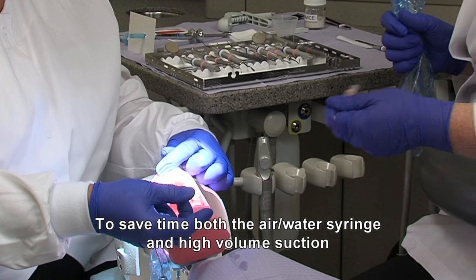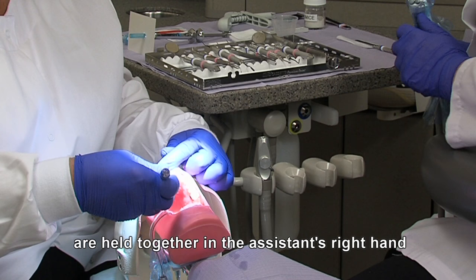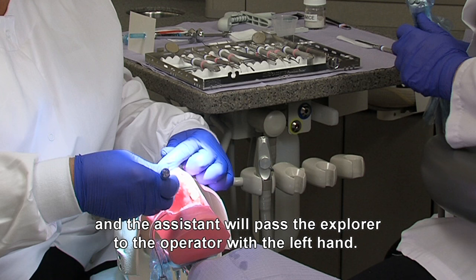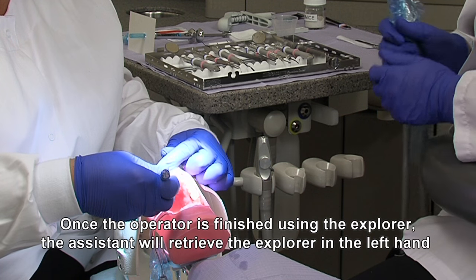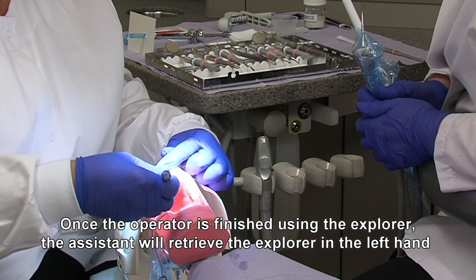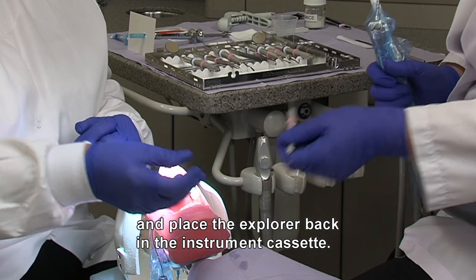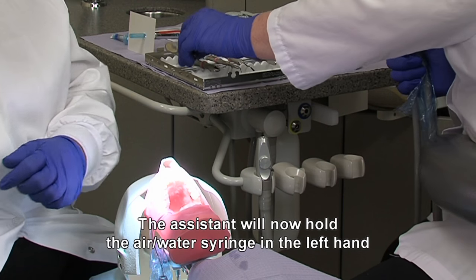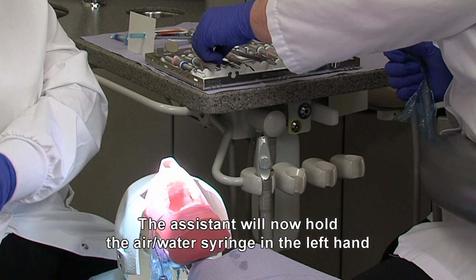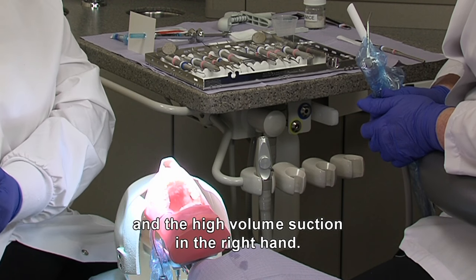To save time, both the air-water syringe and the high-volume suction are held together in the assistant's right hand, and the assistant will pass the explorer to the operator with the left hand. Once the operator is finished using the explorer, the assistant will retrieve the explorer in the left hand and place the explorer back in the instrument cassette. The assistant will now hold the air-water syringe in the left hand and the high-volume suction in the right hand.